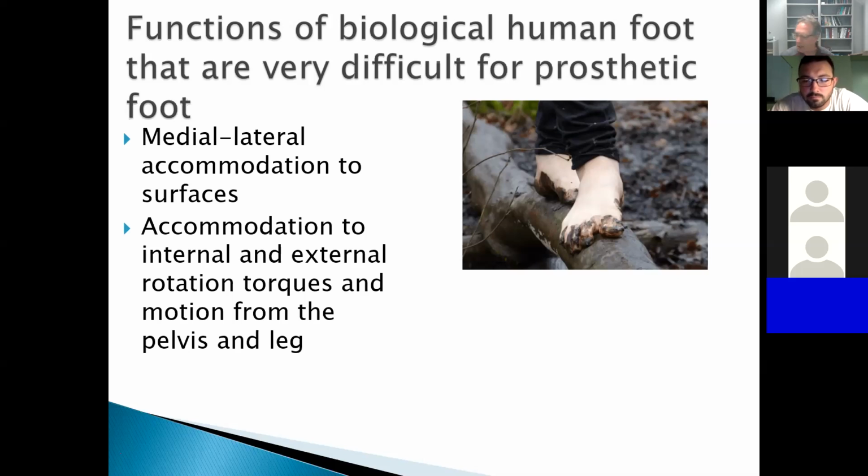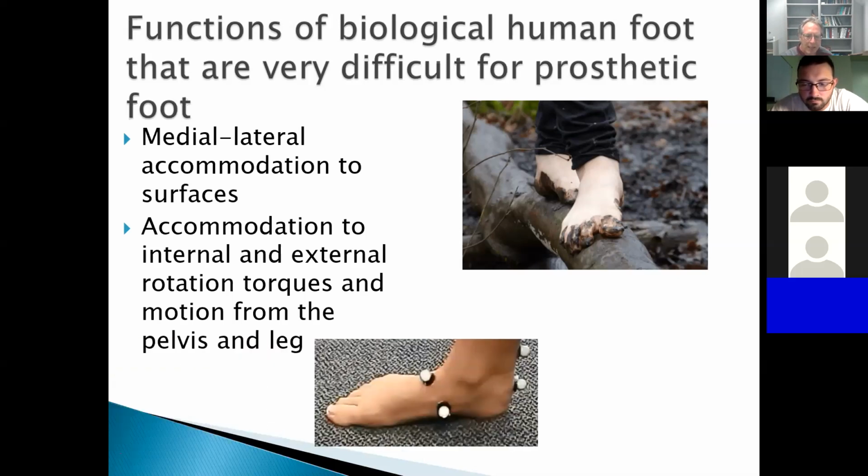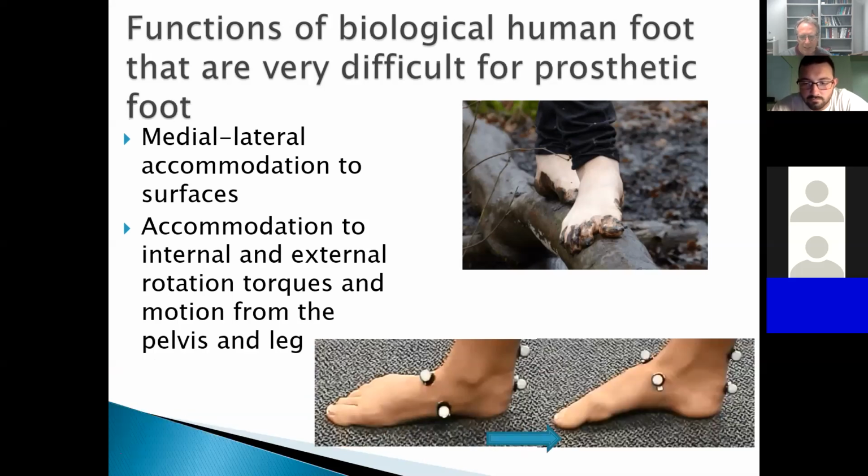We talked about this several times, but it's a really important idea. So first I'm going to show you a diagram, and then I'm going to show you with my body. Remember, here is pronation, and this is an illustration of an individual with a very healthy foot, a very young person, in pronation, and there she is in supination. I'm going to stop the share for just a second so I can show you what we're talking about here.